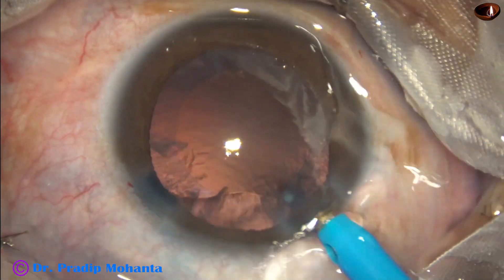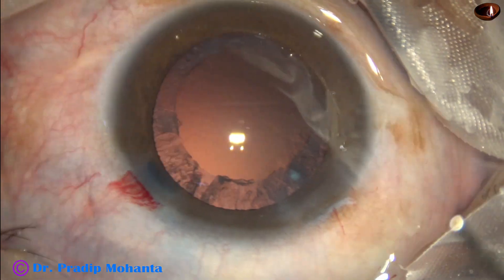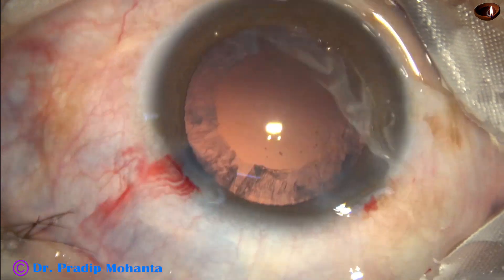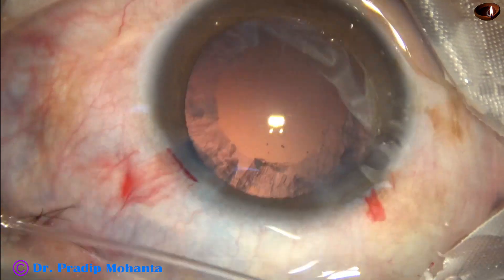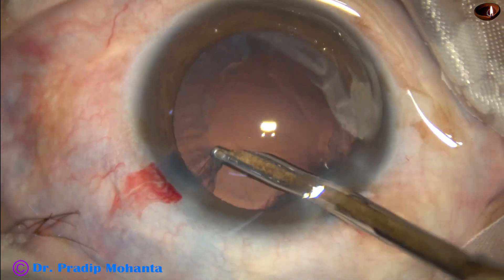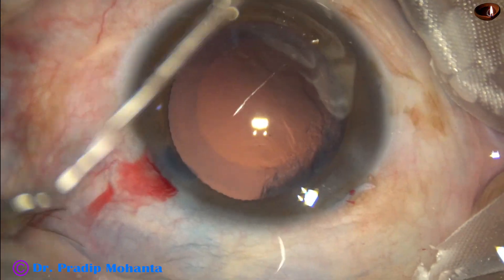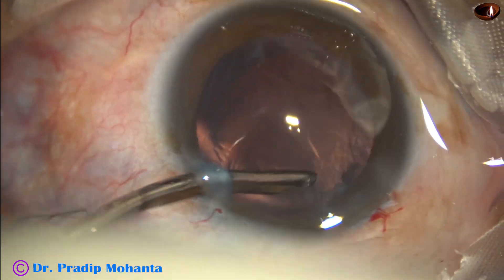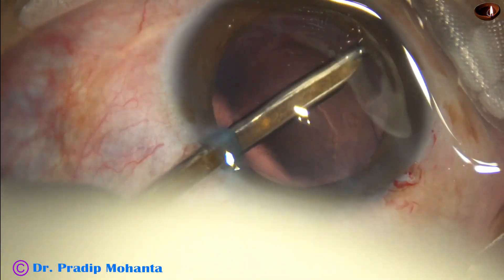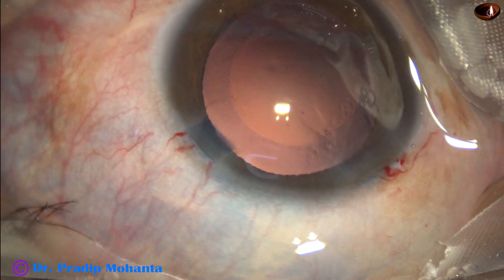And it is done. The nucleus is managed. There is some cortex all around. I inject some viscoelastic, and then use a Simcoe cannula to remove this cortex. Going through the side port to remove the sub-incisional cortex.